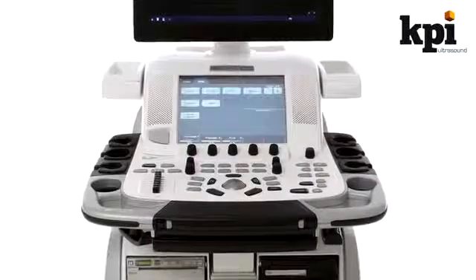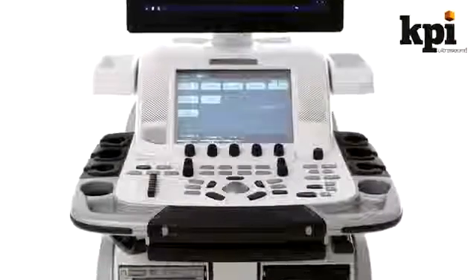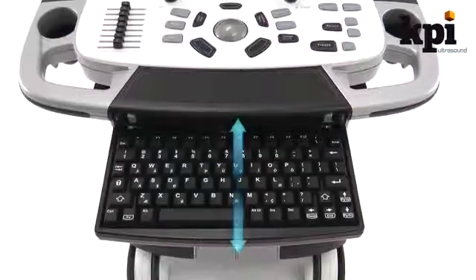Like all premium GE products, the E9 offers a large touchscreen with intelligent menu choices that speed up navigation, while functions that are used less, like the full keyboard, are smartly tucked away when not in use.